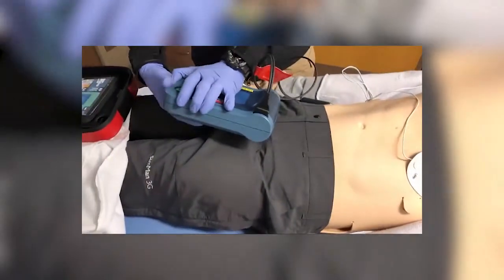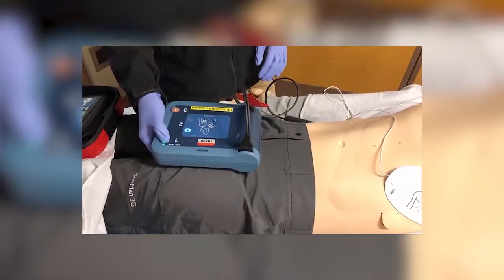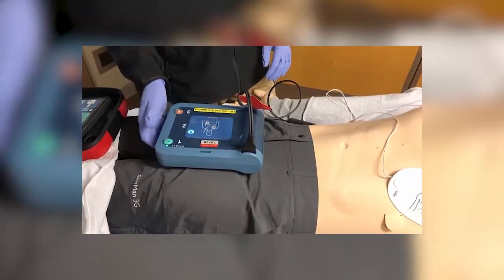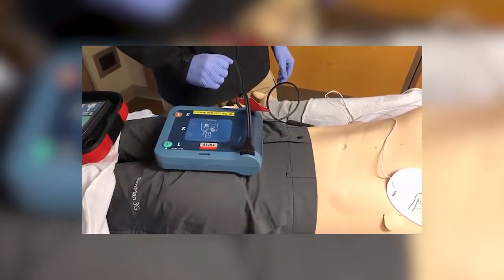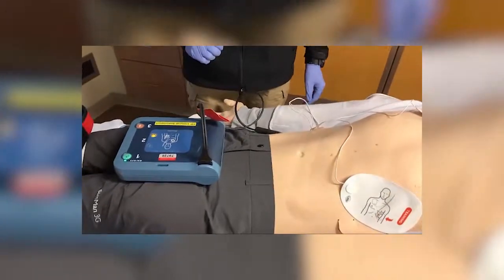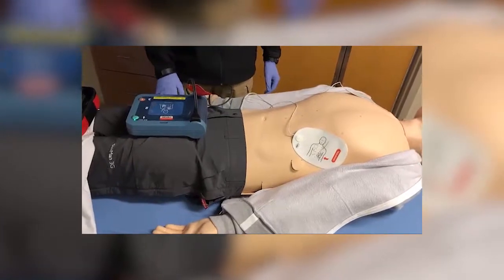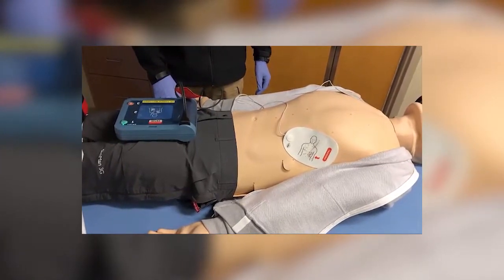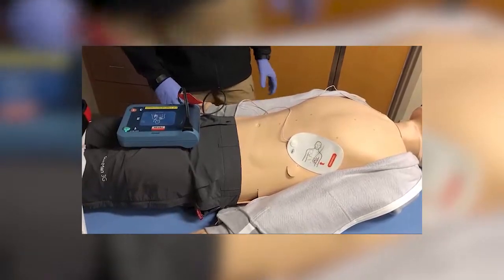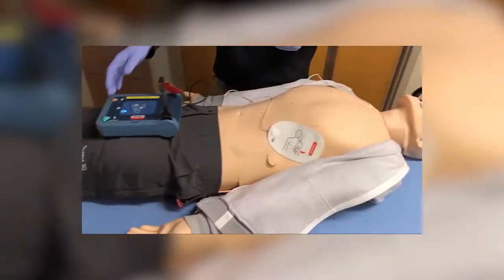Turning on your AED. The device prompts: stay clear of patient, analyzing heart rhythm — and then indicates no shock advised. Be sure emergency medical services have been called. It is safe to touch the patient.